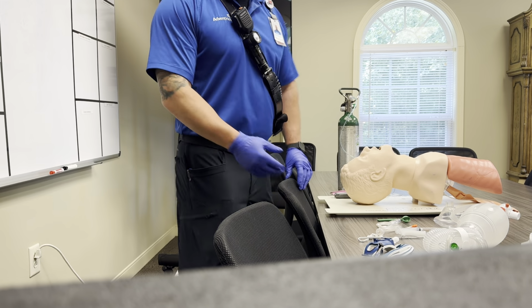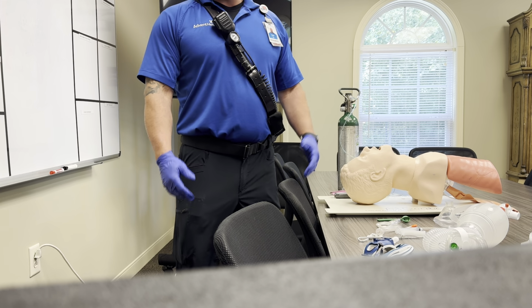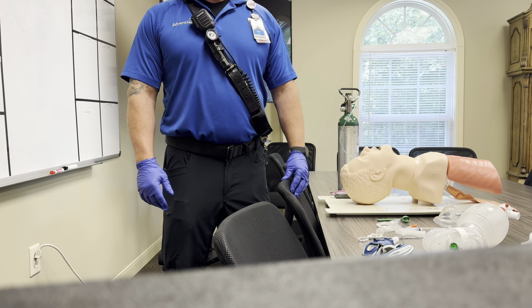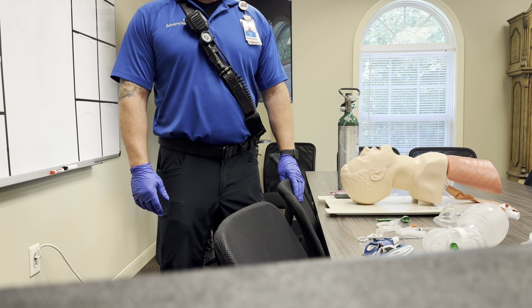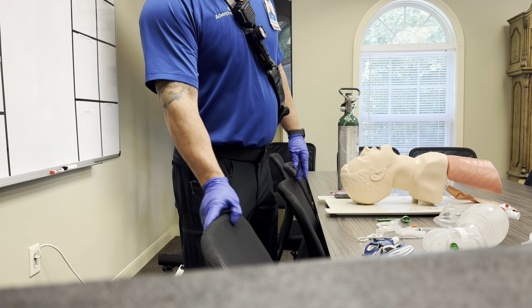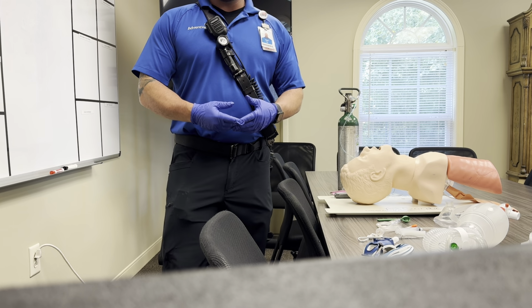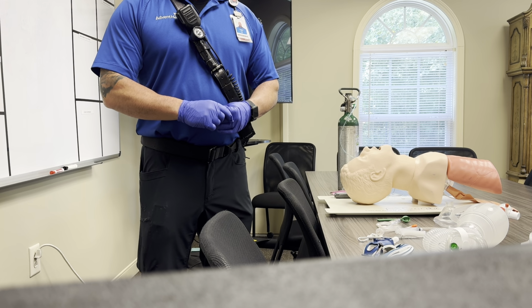Okay, everybody, welcome back. Today we're going to be covering orotracheal intubation. It's a skill that a lot of paramedics use every single day. I know we use it quite frequently at my service. We do want to make sure that we follow our indications and our contraindications.